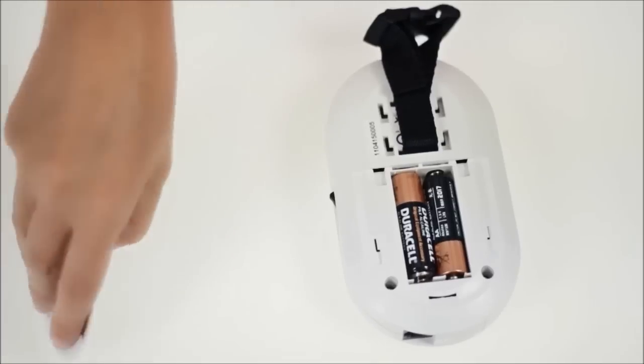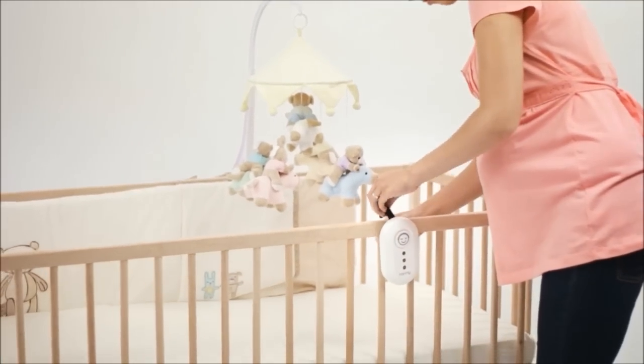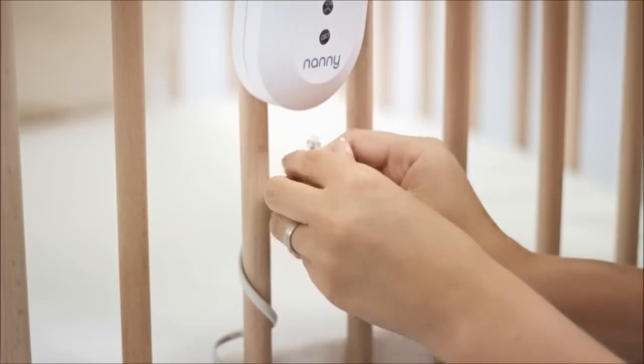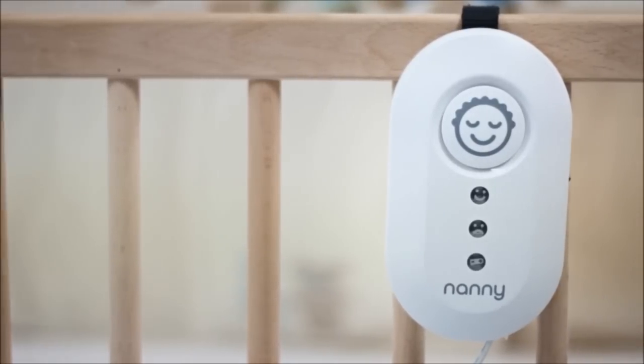Now we need to connect the control unit. First, insert the batteries into the unit and then fix it to the cot and connect the pad to the cable. Secure any loose cable to the cot so the baby cannot pull it. Finally, just check if everything is already as it should be, and switch the unit on.